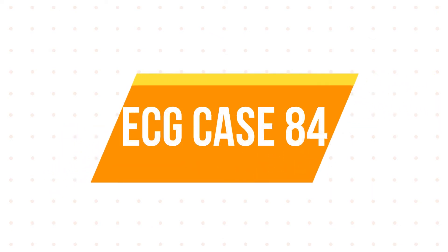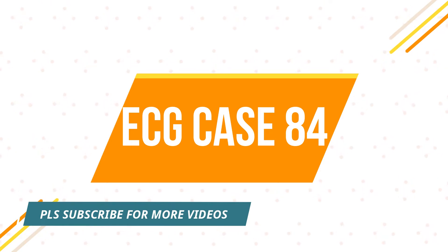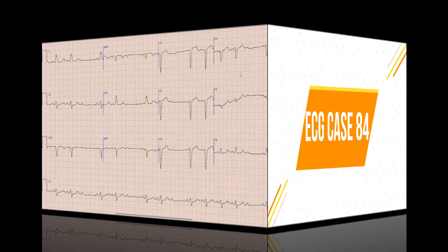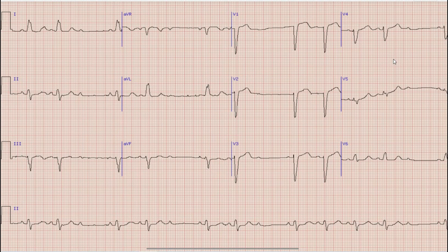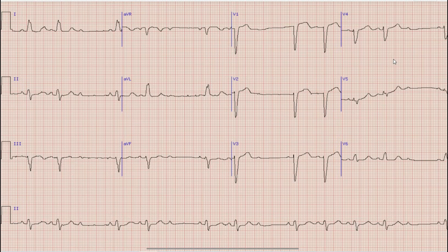Hello everyone and welcome to another video on ECG. My name is Dr. Vajesh Shibir, I have done FCPS in cardiology. This is the ECG which we are going to discuss today. Before going into detail of this ECG, as always, pause your video, note down the findings and diagnosis yourself so that at the end of the video you can compare your findings with the discussion done in this video.